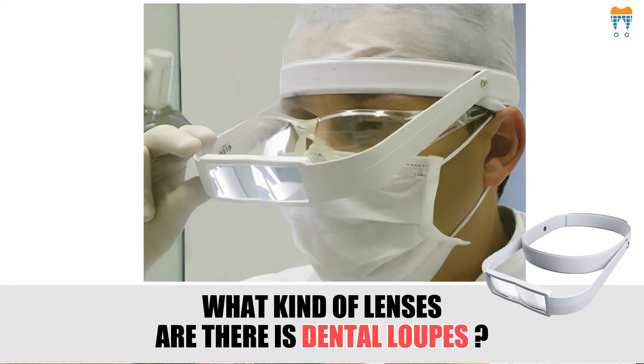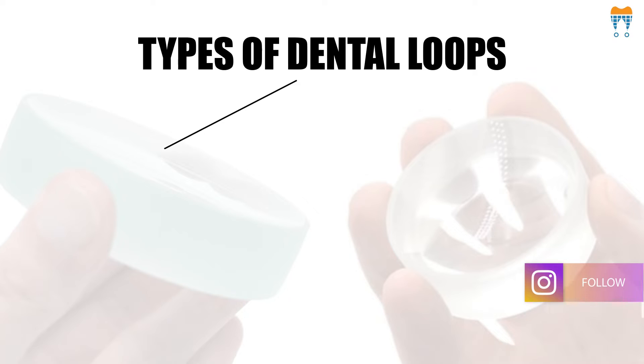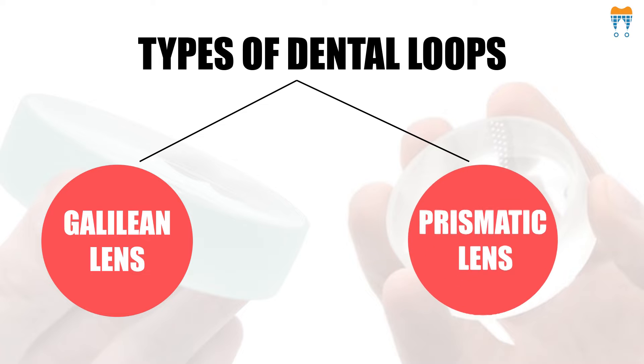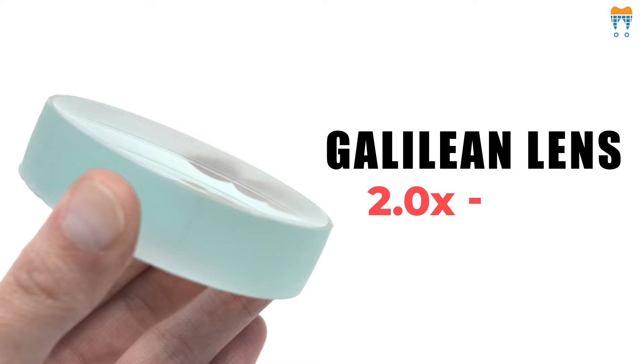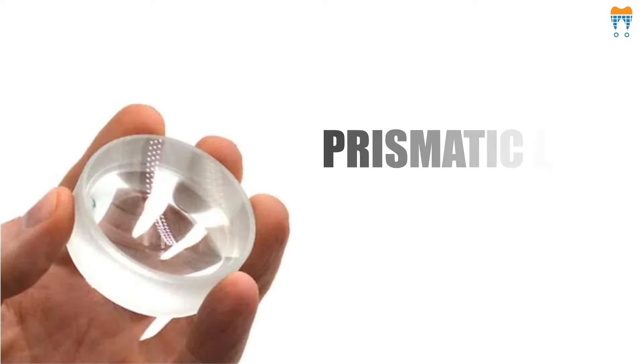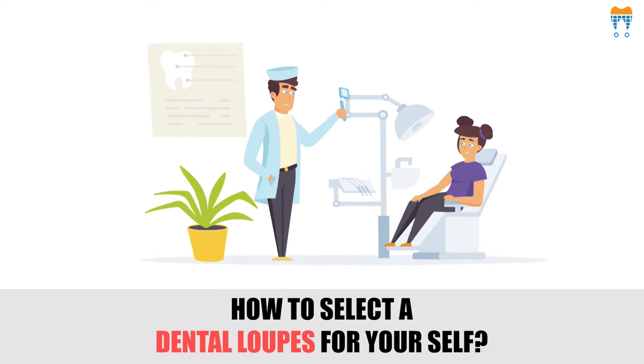Now let's dive into the second topic — how many types of lenses are there in dental loops. There are two categories: number one is the Galilean lens, and number two is the prismatic lens. Galilean lenses range from 2x to 3.5x magnification, while prismatic lenses go from 3.5x to 6x. They differ in the kind of magnification and field of working they provide.